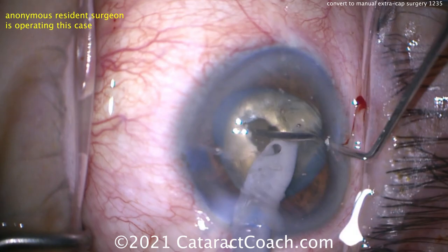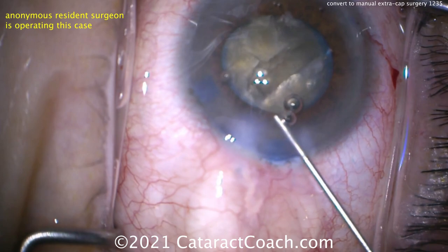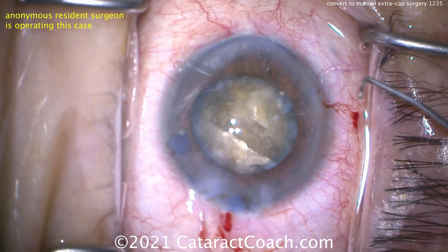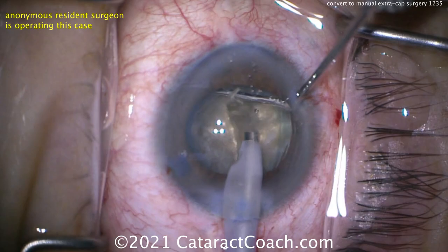That ominous sign is a gap — there's a gap between the iris and the blue-stained anterior lens capsule. Trying to split the nucleus, then trying a chop technique. That looked reasonable, but it still looks a little odd. There's a gap between the iris and the lens capsule. Trying to bring the nucleus up and split it a little, but it just doesn't look good. The attending is helping the resident. There's still an ominous sign — that gap between the iris and the lens capsule.